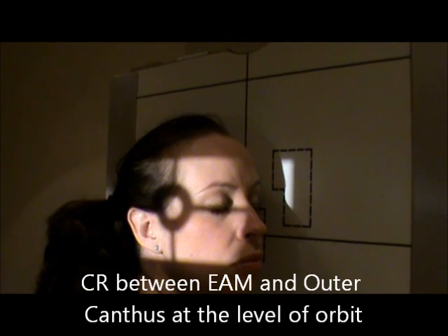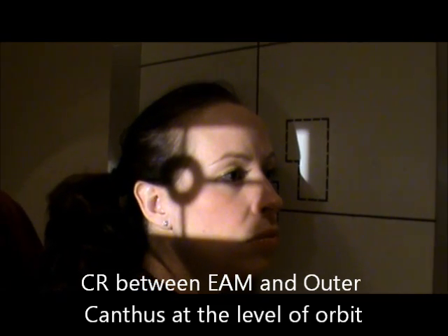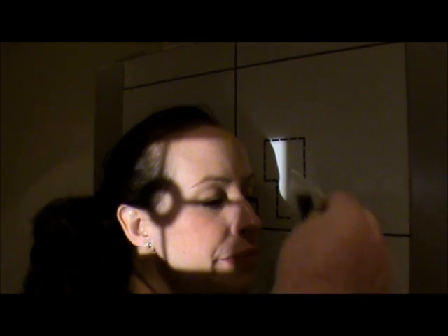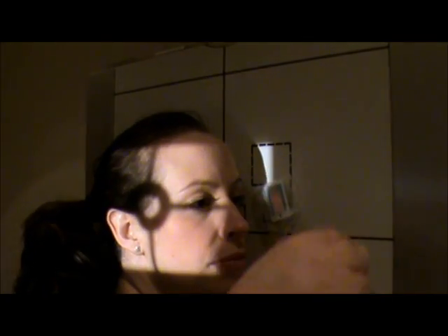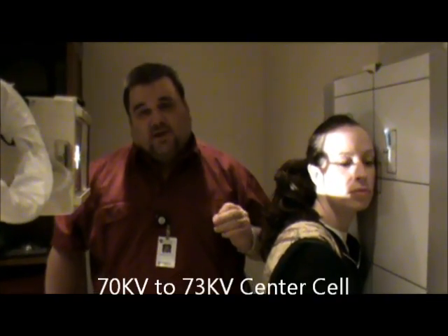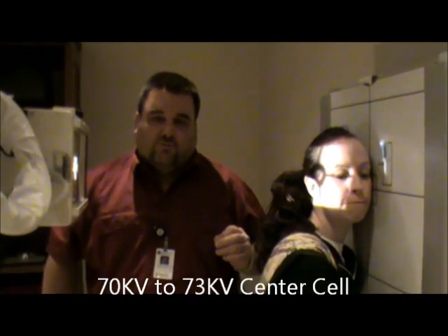I'm going to move her back just slightly. The centering is between the EAM and the outer canthus level — not at the level of the zygoma like it was with the lateral face. Collimation will stay about a 4x4, making sure I get all the frontal sinus on there. I'm going to use my left marker so it's not obstructing, and I'm going to make sure I'm centered to my film. On this lateral view, you should see all four sets of sinuses. The technique goes down slightly to about 70 to 73 kV, center cell. And these are our views for our sinuses.